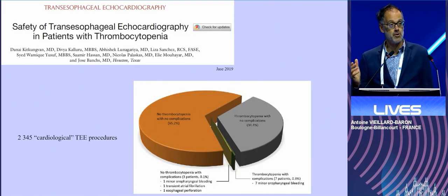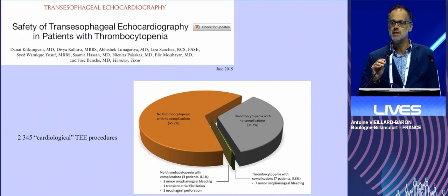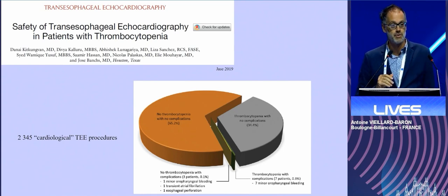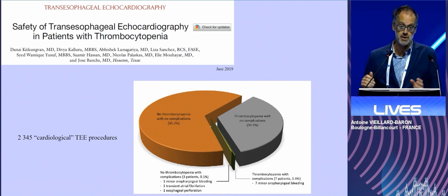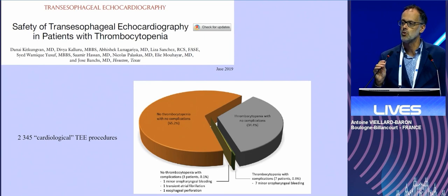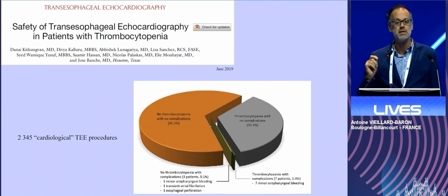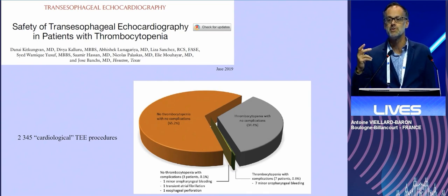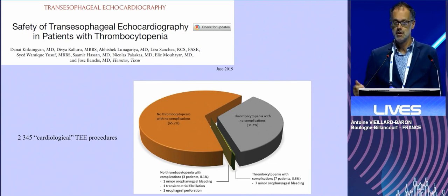One of the reasons also is that, and we have a lot of papers but I just show you this one, TEE only induces very rare side effects. Here it was reported in patients with or without thrombocytopenia, and there was no difference. The rate of side effects was very low, between 0.1 and 0.3%. And it was done in cardiological TEE procedures, so in spontaneously breathing patients, something completely different from the patients we have to manage, who are intubated and sedated.